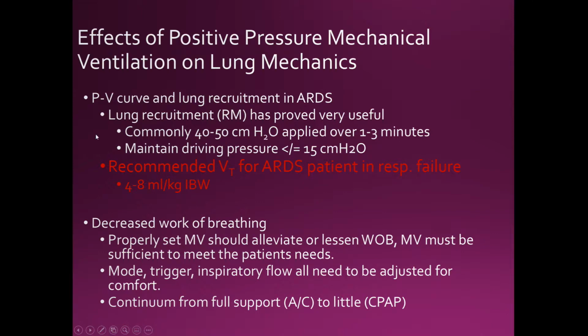So again, with ARDS, lung recruitment or recruitment maneuver is useful. Normally we want to keep it open at 40 to 50 centimeters of water pressure over 1 to 3 minutes. Okay, and then we want to maintain a driving pressure of less than or equal to 15 centimeters of water pressure. Now this is mostly talking about your recruitment maneuver.